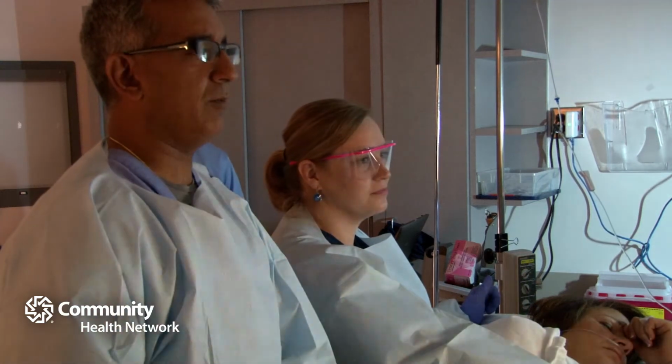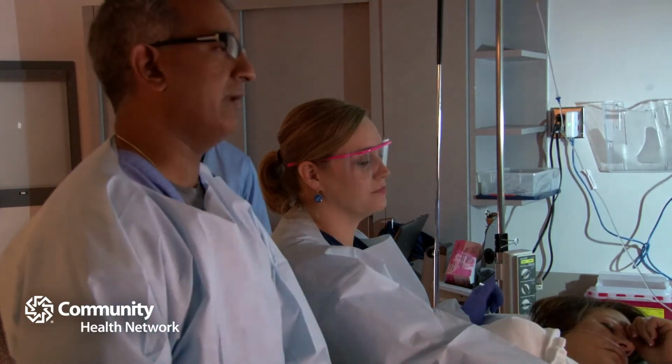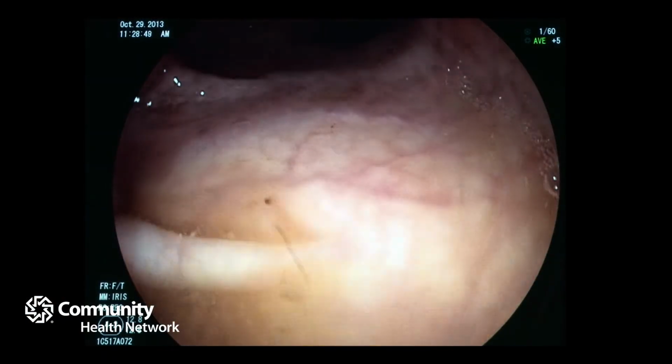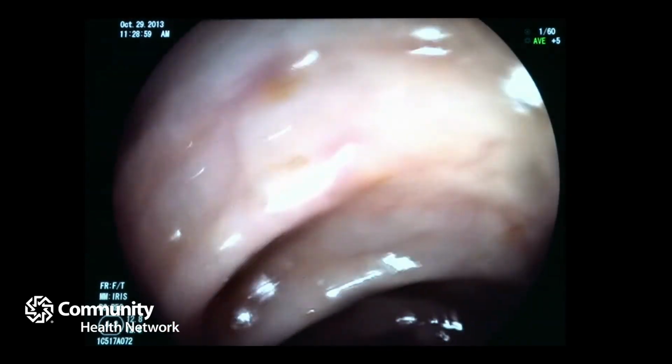So we're really almost done. We're almost at the end point. We started working our way out. Again, I look both ways. If I see a polyp that's pretty small or I'm not going to find it later, I try and get it on my way in. Sometimes you'll find something else that's a little bit bigger and you know where it is, and you can get it on the way out so you can do whatever you want to do with it. If you really want to get all the way through, you want to take your time.